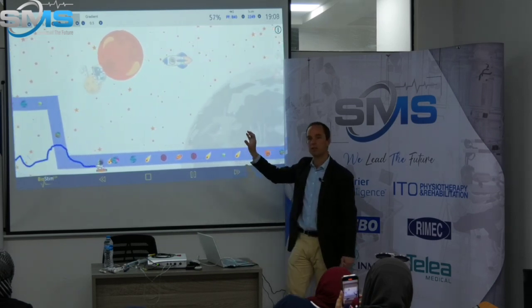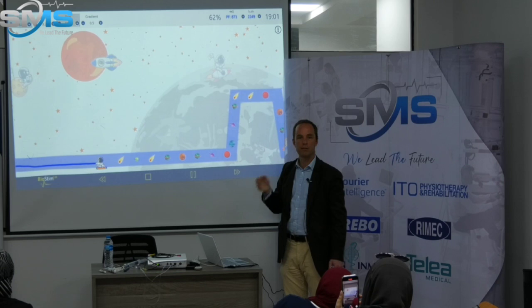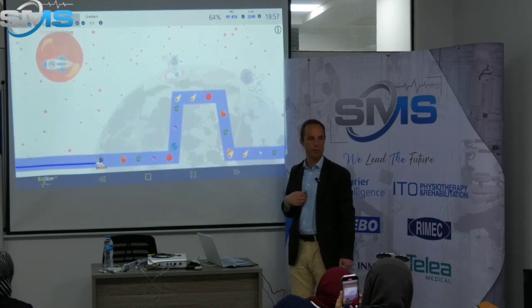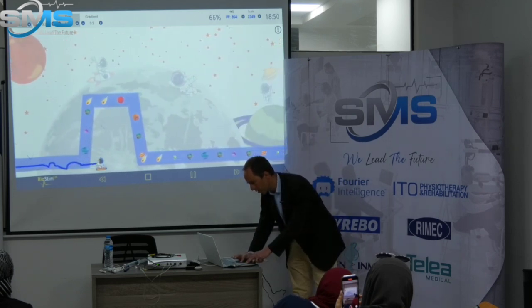Again, it's very important to adjust everything, because if your patient succeeds, she will continue and she will have some results. If she thinks she's failing, she will stop and go back home with her problems, and that's not what you want. Okay, so here it's okay.